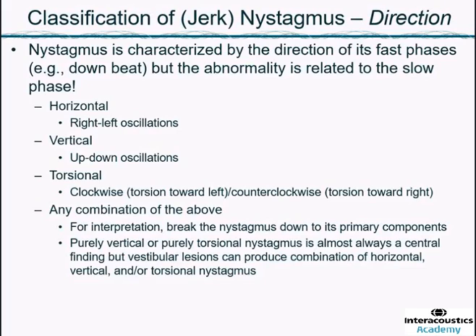In the old days, we were taught that if you have vertical nystagmus or torsional nystagmus, it's always central. We know from our experience with BPPV patients that the terminology is probably not quite right.